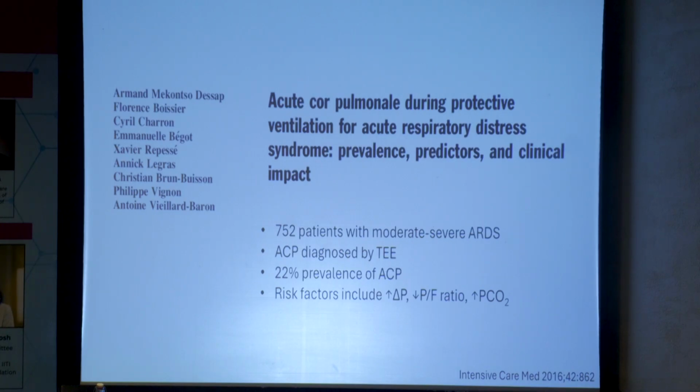For the cannulas, what is the theoretical and practical limit to how long we can keep them inside once we put them in? When I have colleagues who give these talks, they say from the beginning that the FDA indication for these cannulas is 6 hours or less of support. And clinically we have patients who have had months of support. Almost a year, yes.